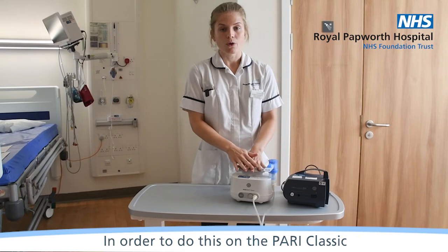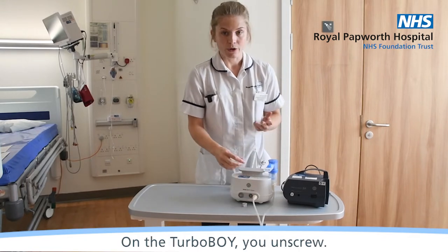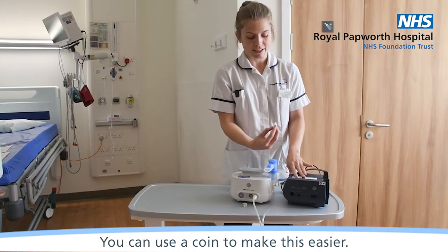In order to do this, on the Pari Classic you pull out from the front, and on the Turbo Boy you unscrew. You can use a coin to make this easier.